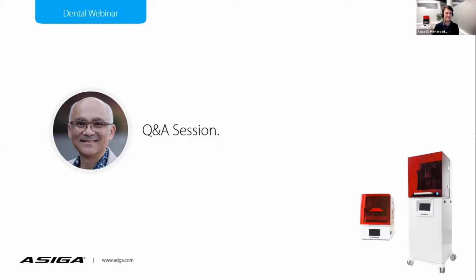And lastly, we had to get another little one because Graham took 6 months to get the 4K to us. I think, did we get the second machine in Australia, or we waited for a little while for that, but we finally got it. Yeah, I'd have to get back to you on that. I'll confirm. It was nice.